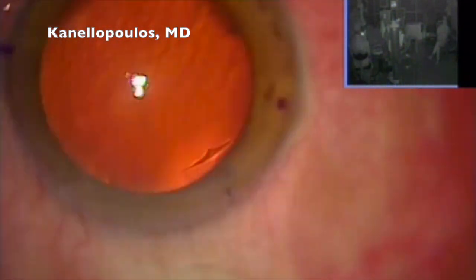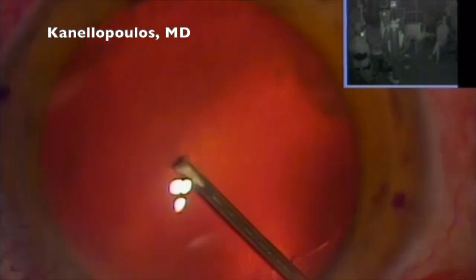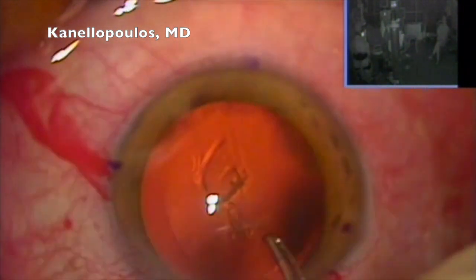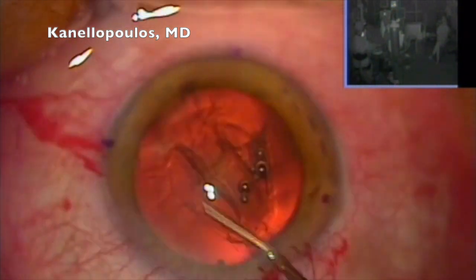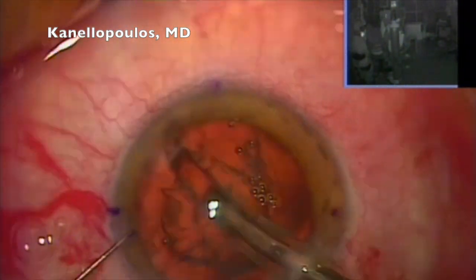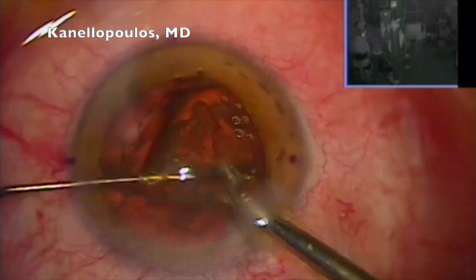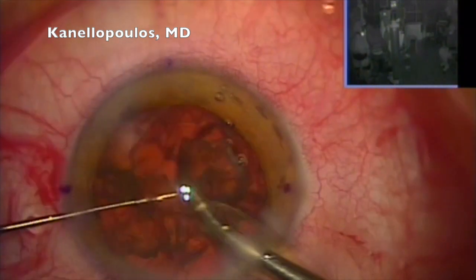And again, we're basing our data on preoperative cornea tomography, and also the IOL Master 700, which is spectacular in IOL calculation through the very nice cornea imaging that it does with total corneal power. We have compared this to our Pentacam total cornea, actually 4.5 central keratometries, and it's very similar.